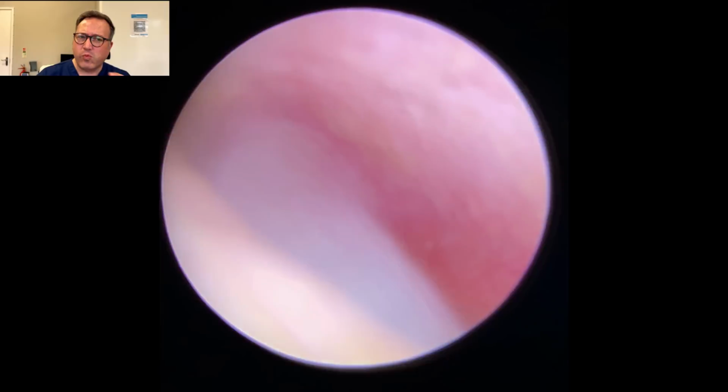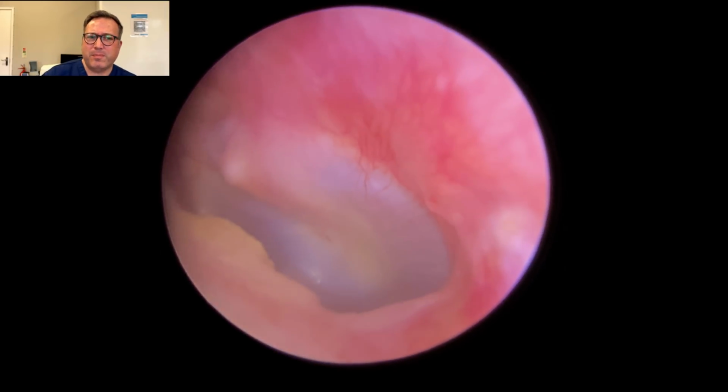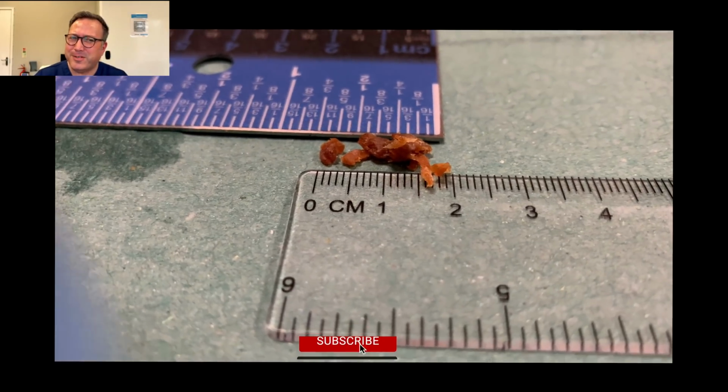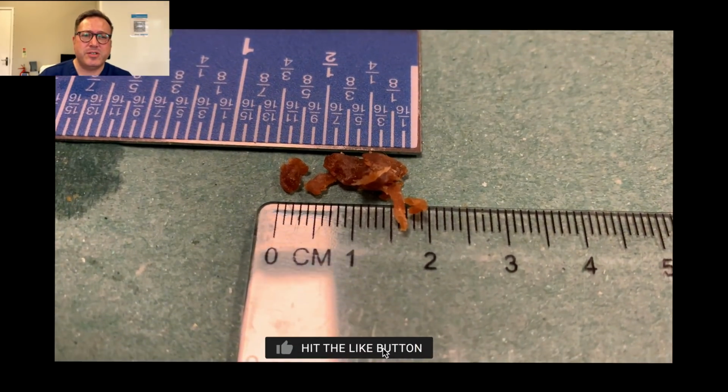So out it pops. So you can see how you had to work that a lot more to get that out. You can see the redness there to the canal as well. I could have gone and got the last little bit, but I'd put the patient through enough already. So this is what we removed. You can see 2 centimeters, 3/4 of an inch there.